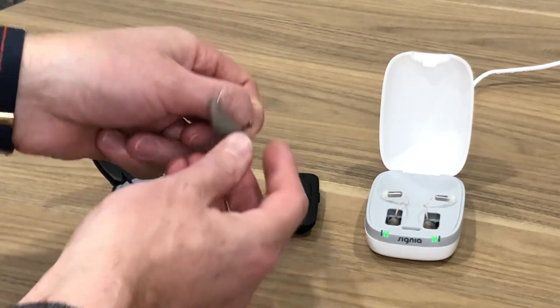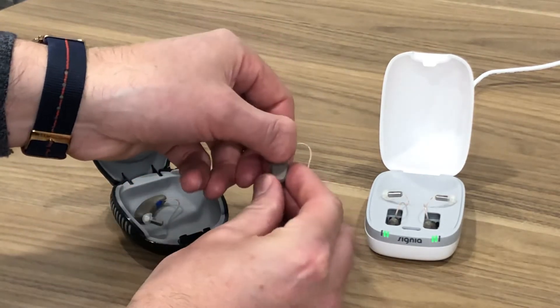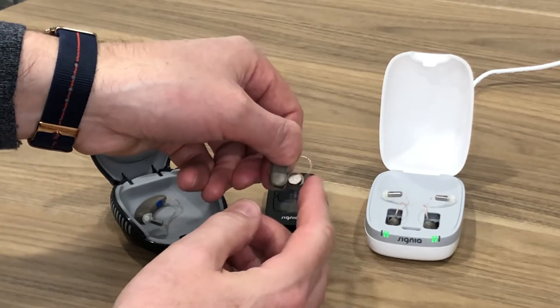They run on a 312 battery — that's the battery size. So at the base of the hearing aid, if we open up the battery compartment, there's a 312 battery here.